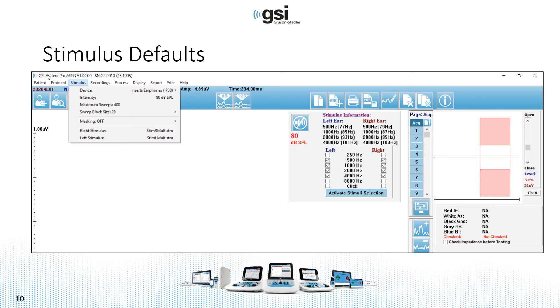And you'll be able to see that during the collection. I wouldn't recommend increasing that because you could potentially be testing longer than you need to should a response appear.